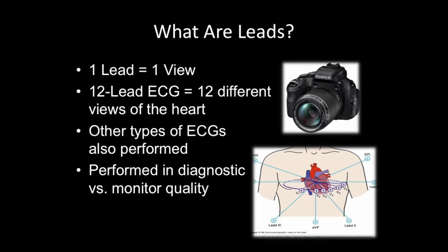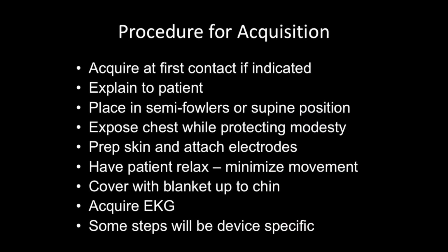Okay, so when we first see the patient, we like to explain to the patient what we are doing, because you're going to bare their chest, so an explanation is always good. You want to have them in a comfortable position. You don't want them tensing up or having any muscle contraction. Nice and easy, nice and relaxed. You have to expose their chest, so protect their modesty. Not with the back doors open, or if you do it in the ambulance, not the whole family come on in and take a look, right?